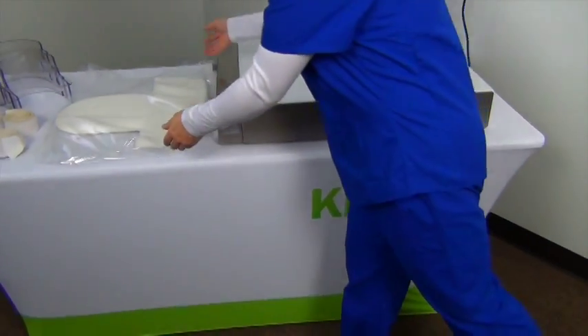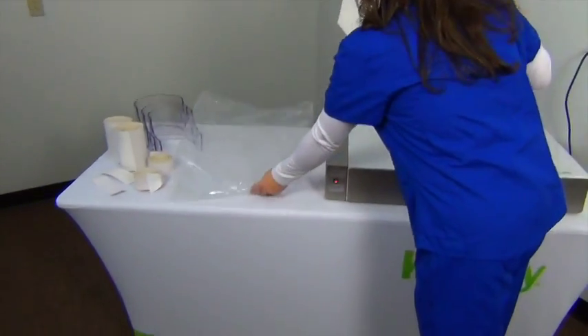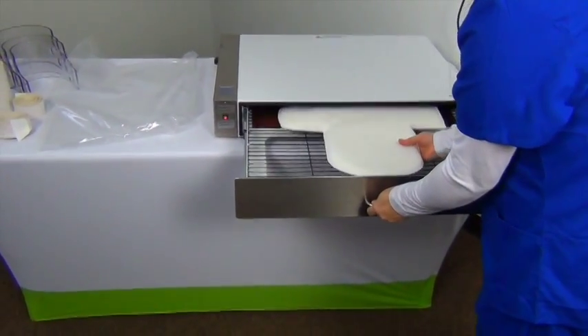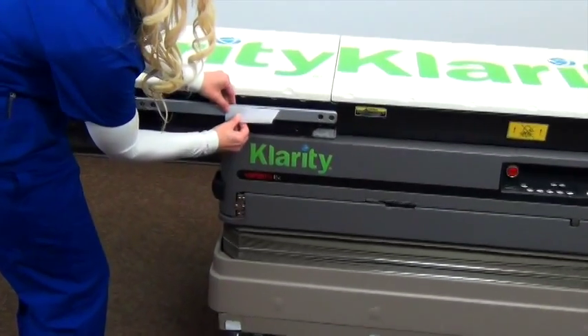Begin by setting your oven or water bath to 165 degrees Fahrenheit or about 74 degrees Celsius. The cushion will be cool and firm when you begin, but it will warm up quickly in 20 minutes. While the cushion is warming up, prepare the rest of the Clarity shell system.